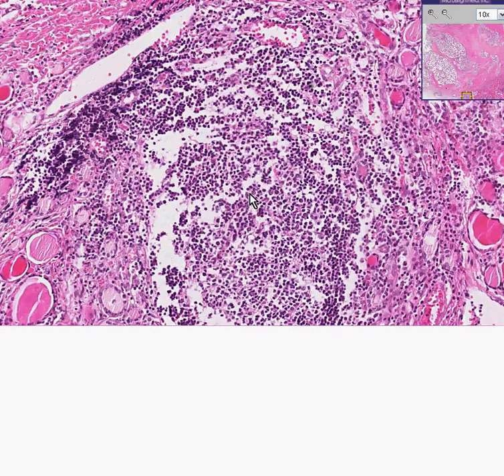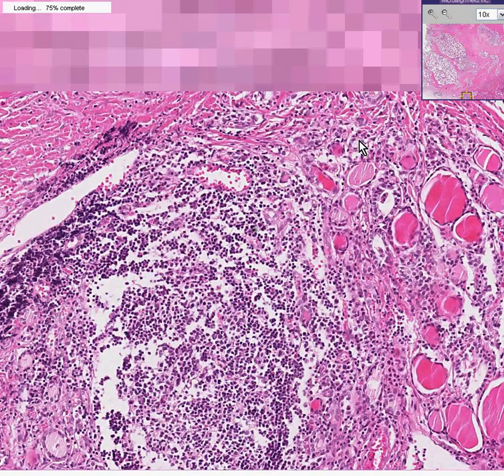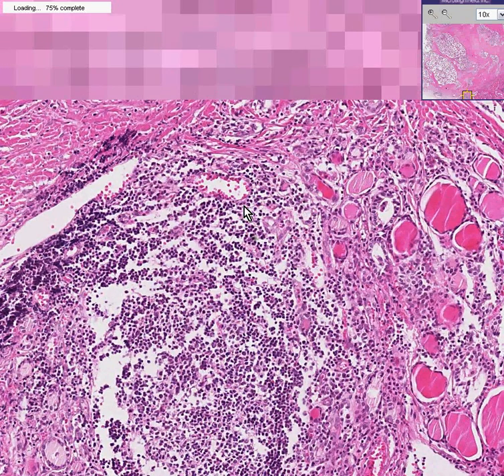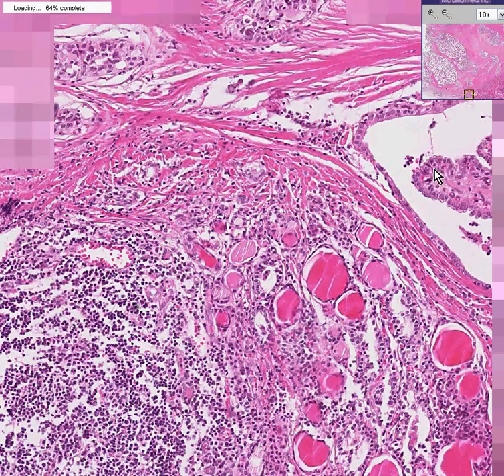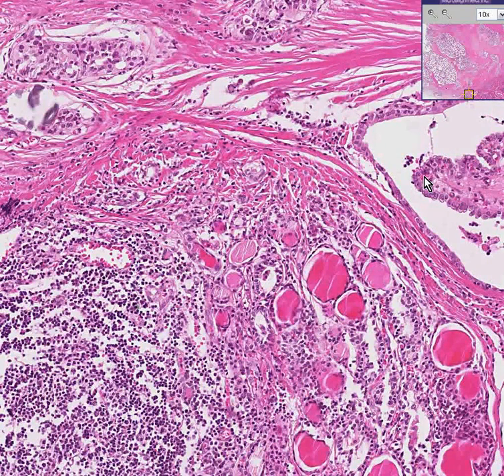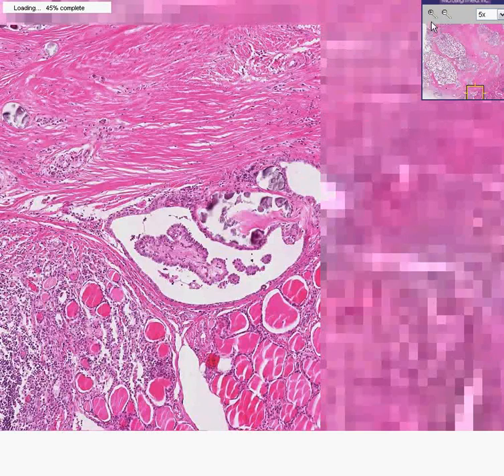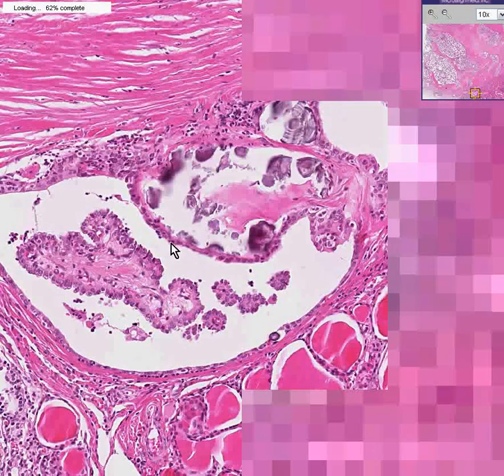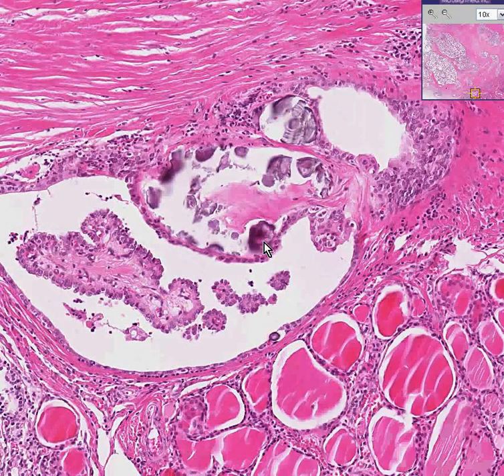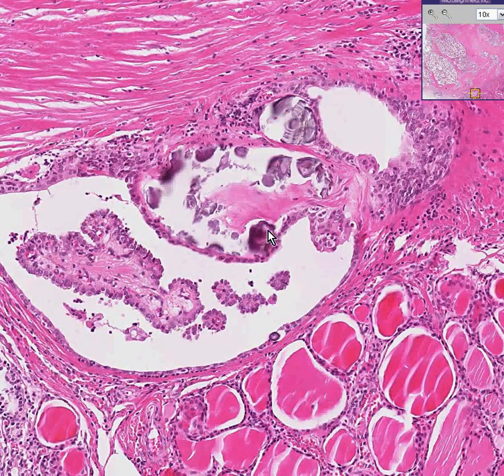But if you decided to look at the rest of the thyroid gland, you would also see structures like this that perhaps look like a little papillary structure. Let's back up quite a bit — you can see these are indeed well-defined papillary structures. In addition, like in many papillary tumors, some of these little papillae dry out and calcify to become little concentric calcified bodies called psammoma bodies.